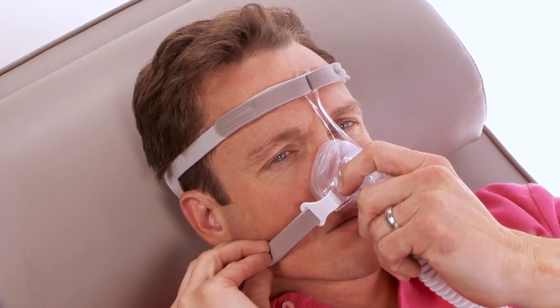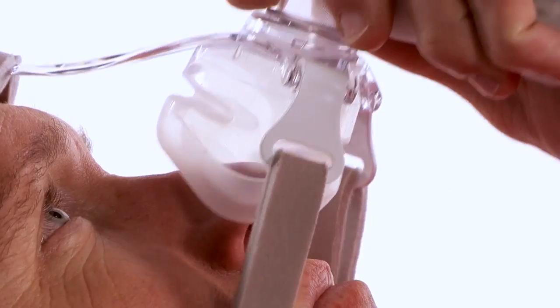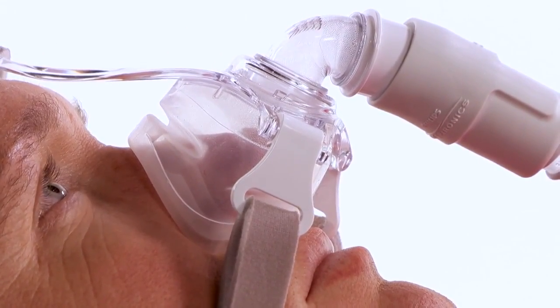Some air leaking is normal. If you feel a large leak, reseat the mask by pulling it directly away from your face and gently setting it back into place. This allows the mask to create a new seal.